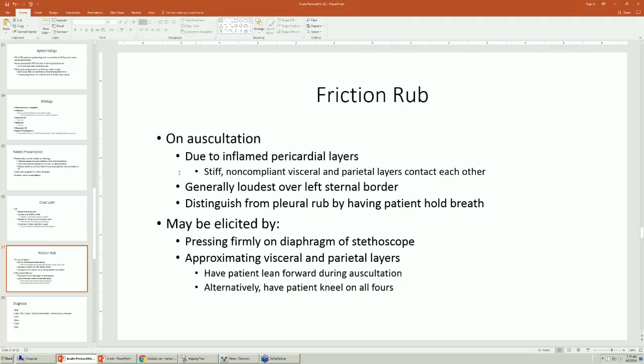And the diastolic murmur heard is totally different than a friction rub. The friction rub has deeper sounds and creaking sounds and sandpaper-like sounds. And so, yeah, you press the diaphragm of the stethoscope on the chest. You've got to make sure it's not the heart moving the skin against the diaphragm. So you can get that with an active apex and think you have a rub. So you've got to really press the stethoscope hard to make sure that you're not getting skin activity rubbing against the stethoscope.